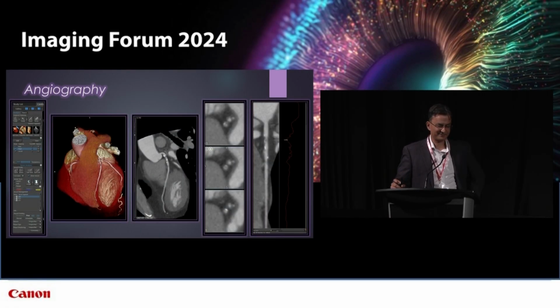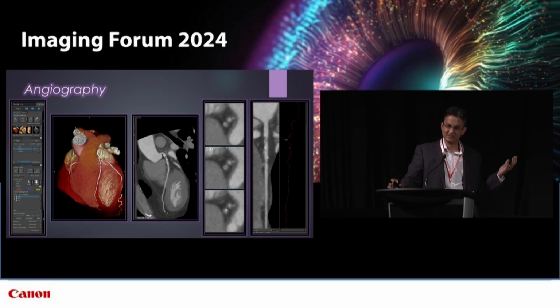There it is. I thought I would add this example to highlight similar utility for coronary assessment. Many cardiac radiologists, myself included, typically use manual MPRs with double oblique planes to interrogate coronary segments. It sounds counterintuitive in this day and age. You're like, well, we've got all this fantastic segmentation software. Why are you doing things manually?